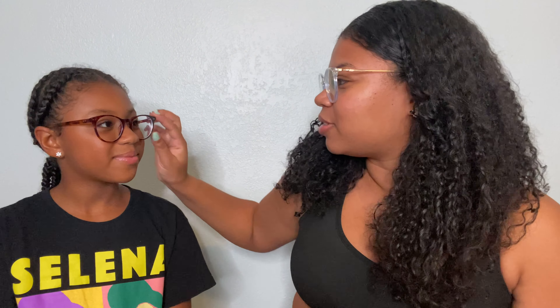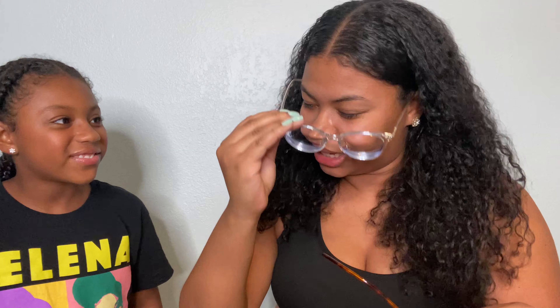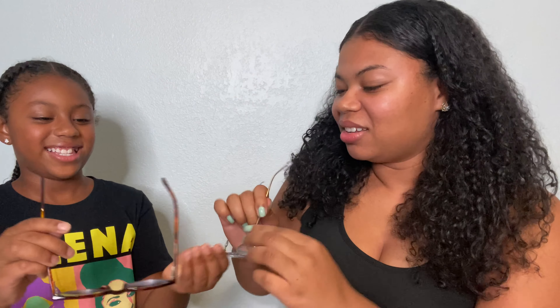I actually want to try yours on just to see if they'll fit — they're so cute. Oh, they do fit! That's just how it would fit on my head. If you put mine on they'll be blurry, but yours are blurry only because they're not strong enough for me. Oh my goodness, I can't see! Don't keep your eyes open too long. Okay, we can swap back. Thank you so much to Zinf for sending us these frames.